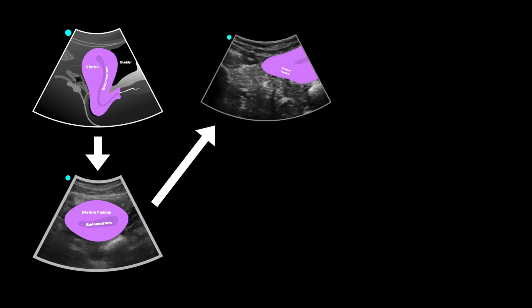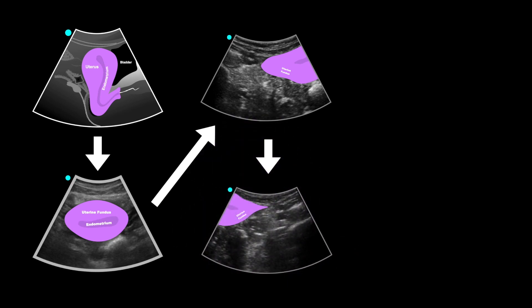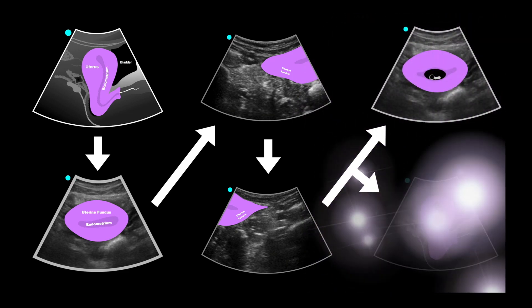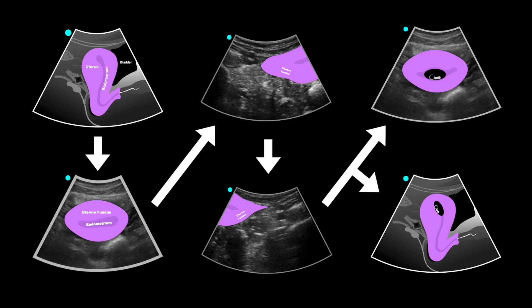After that, I like to look at the right adnexa first — I angle my probe over towards the patient's right. You can see the pelvic brim coming through there, and then the uterus over towards the medial side. I look in that area for any adnexal masses, and if I can see the ovaries, I want to make sure we don't miss anything. Then with the probe marker still towards the patient's right, I angle over towards the left at the level of the fundus, checking the adnexa again for any masses. If a pregnancy is visible in the uterus, I evaluate it; if not and a tubal ring or other pathology is seen, I evaluate that.